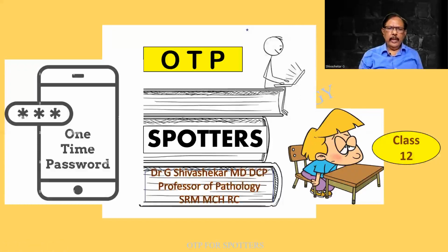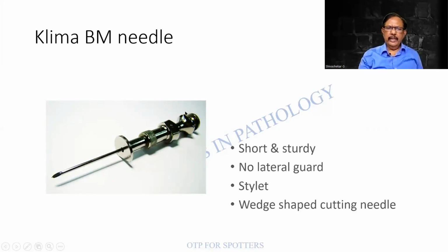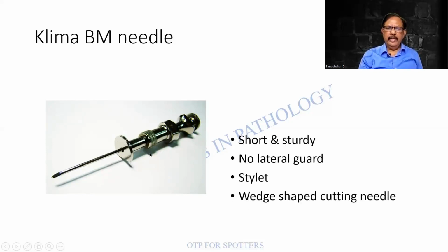OTP, one-time password, class 12, spotters for undergraduates. Now, in this, I am finding a stout needle, which is quite sturdy that it can pierce even a bone. The needle is short and sturdy or stout. There is no lateral guard in this case. Guard is something that is preventing over penetration.